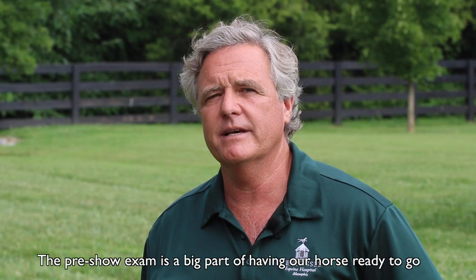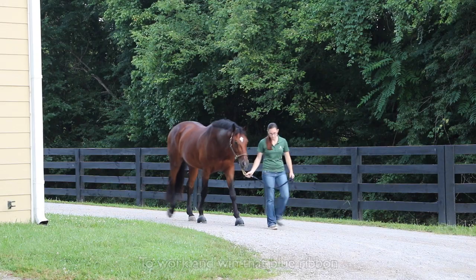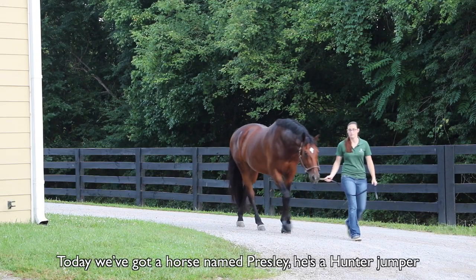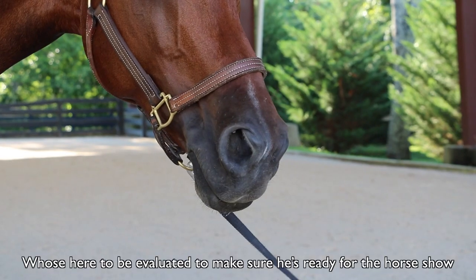The pre-show exam is a big part of having our horse ready to go to work and win that blue ribbon. Today we've got a horse named Presley. He's a hunter jumper who's here to be evaluated to make sure he's ready for the horse show.